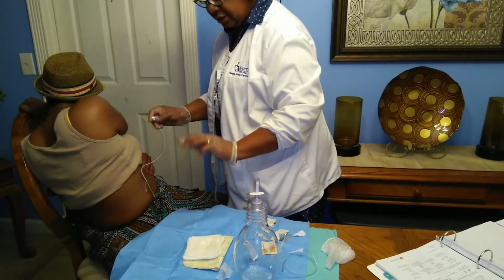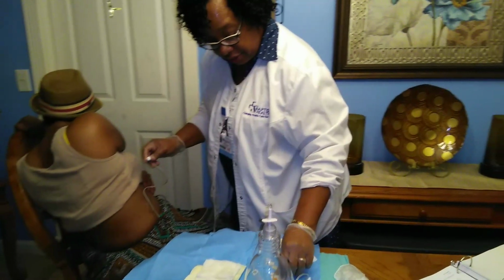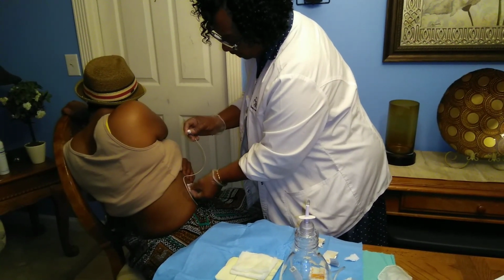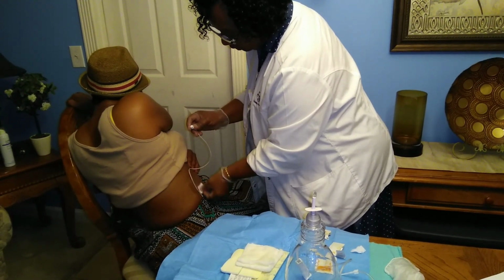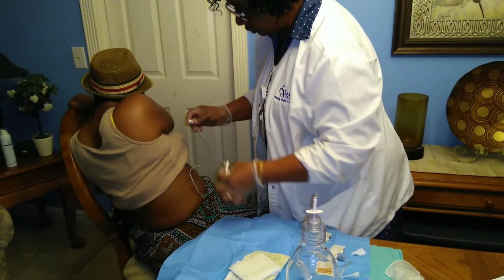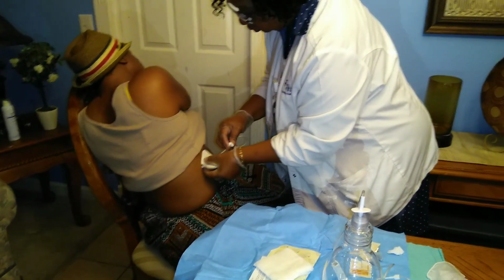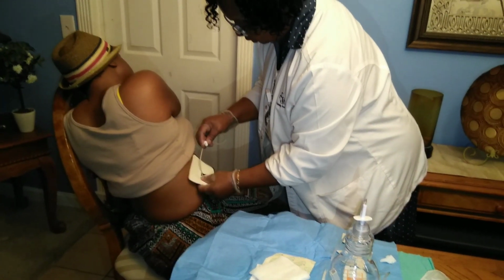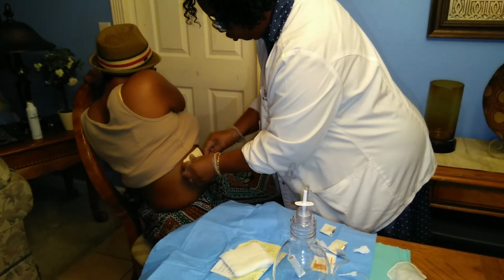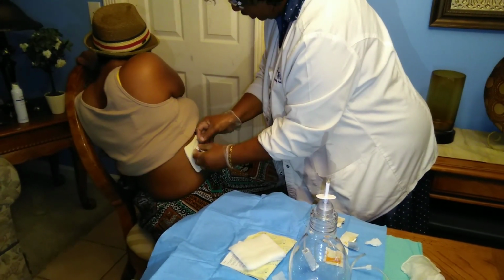Okay. Now this is the key. You want to take your dressing. You're going to take that third alcohol pad before you put that dressing on, and you're going to clean around your insertion site from the inside out. And I'm going to take my foam dressing. My foam dressing goes around my catheter like so. This wraps around on top of my foam dressing to prevent this from going into the patient's skin.